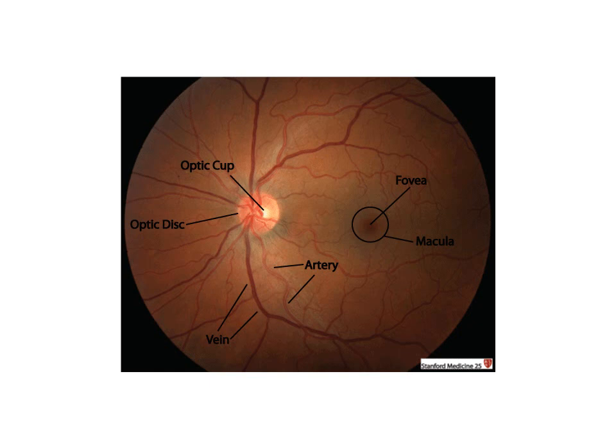This is the normal fundus. This is the picture of the normal fundus. Based on this, you should be able to identify any exudates, hemorrhages or any kind of changes which are present in the posterior segment of the eye.